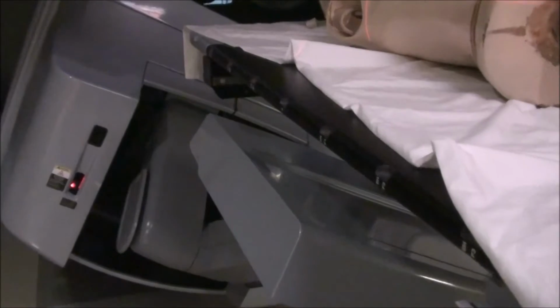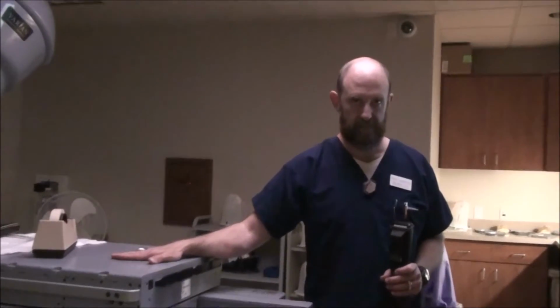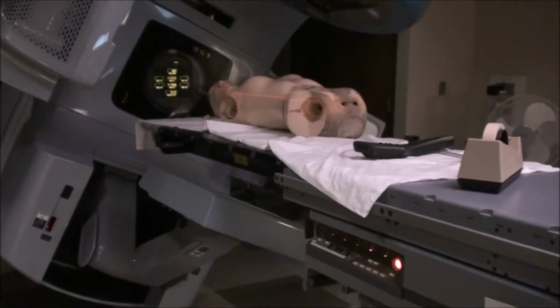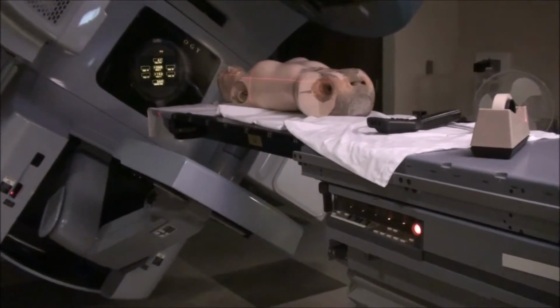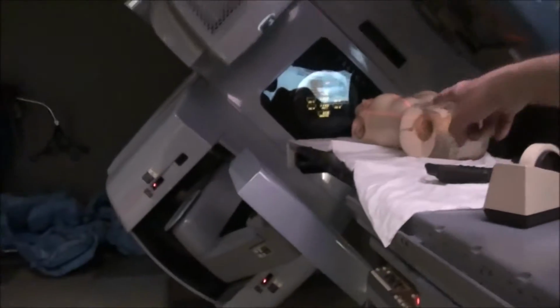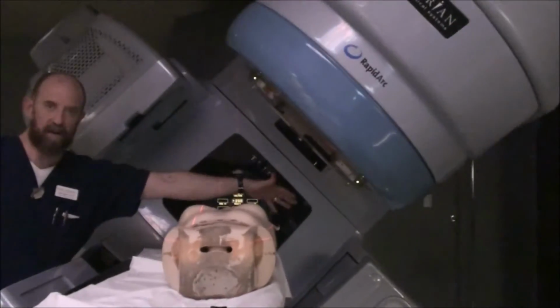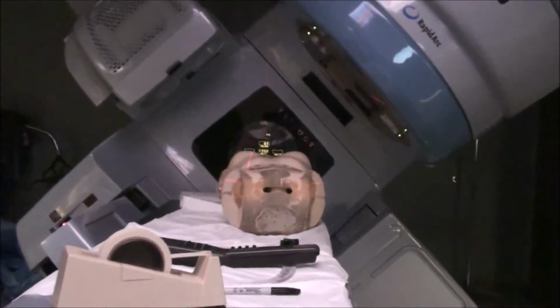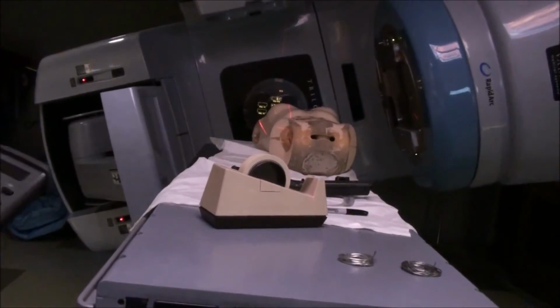What you now have to do is notate where your table is in space. My table lateral is 982.1. You're going to move your patient over, and then you're going to rotate your gantry, carefully watching both. Now, you can see we're clear here, but if Pixie had arms, we would have a problem up here. You don't want to tear her arm off rotating over with the gantry. So you're going to watch both. As we rotate, I'm not killing my patient, I'm not ruining the equipment, both of which are very important.